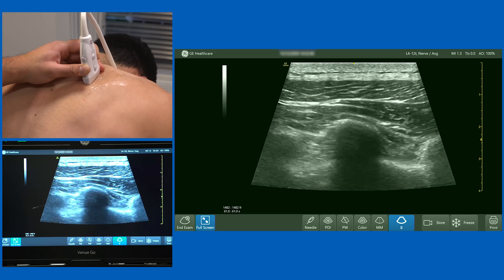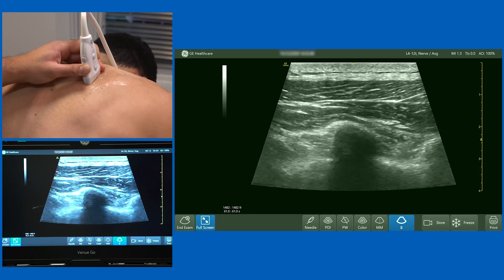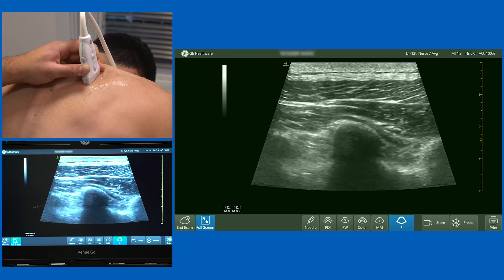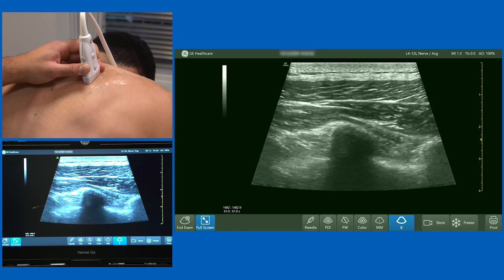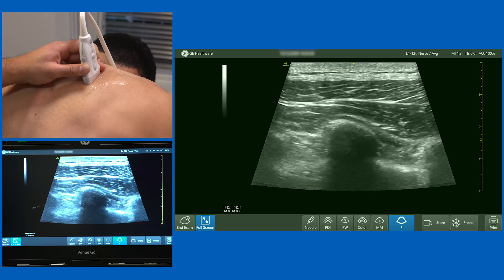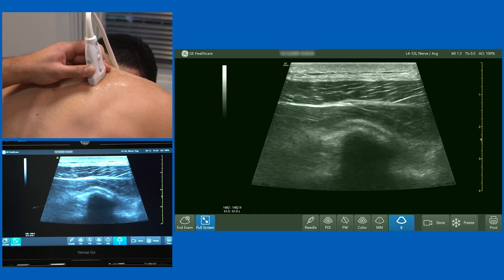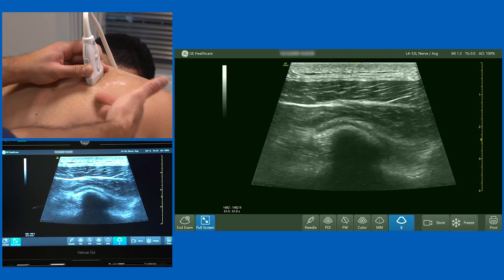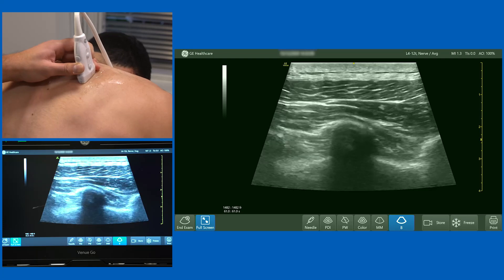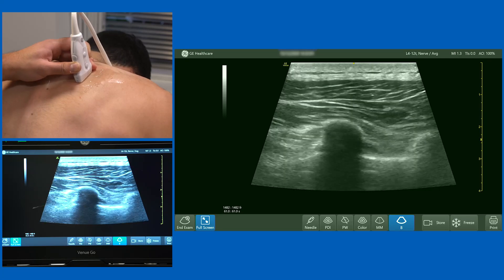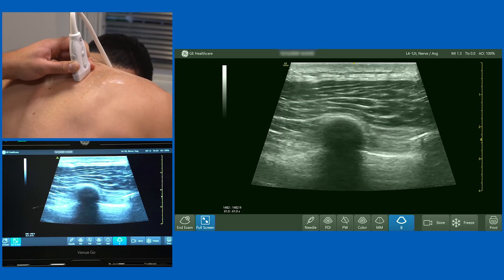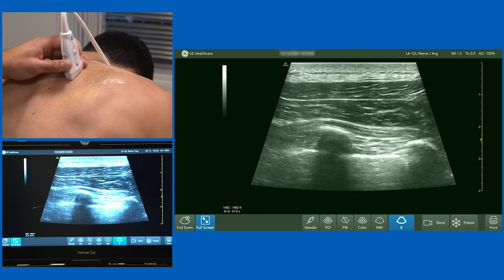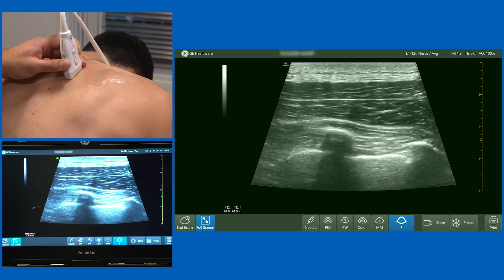Starting at the top of the screen, we've got a very small amount of adipose tissue and then a couple of muscles. The most superficial muscle is the trapezius, and deep to that is the rhomboid. I'm now going to slide from lateral towards the midline, and as I do, you're going to notice a muscle bulk that becomes more and more evident.